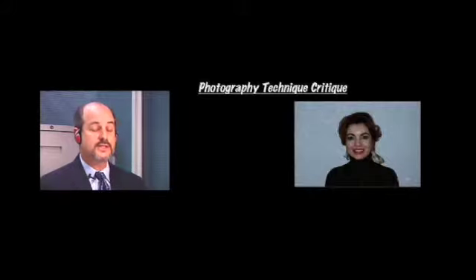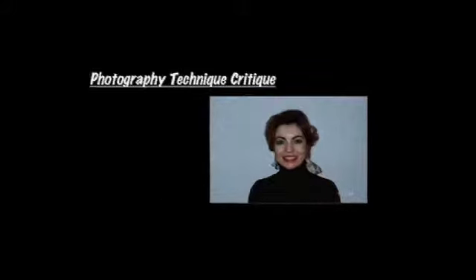So this picture here, if we look at this one example that I have, which is what is incorrect about this view. What view is this? Okay, I'm sure you all know this is supposed to be the 1 to 10 view. Well, that isn't 1 to 10. We have too much of her. So as we said, we really only want to see maybe a little bit of the neck, really none of the shoulder, no shoulder, and we want to see the top of the head and the nose to split the X and Y plane. That's classically the 1 to 10 view.